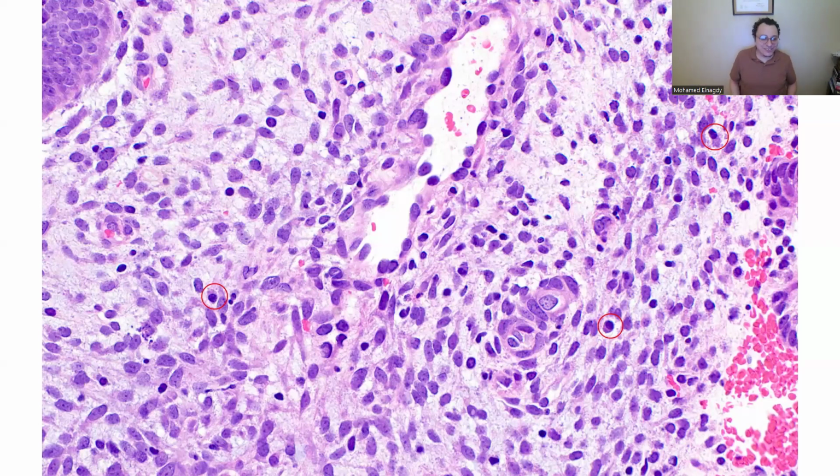So you should say, well, thank you, Muhammad, for highlighting the diagnosis for me. But see, I'm telling you how scant the plasma cells might be. They might be very scattered, so you have to look carefully. That's why I really recommend, in any case with an endometrial biopsy, open the history. Open the history in every case.